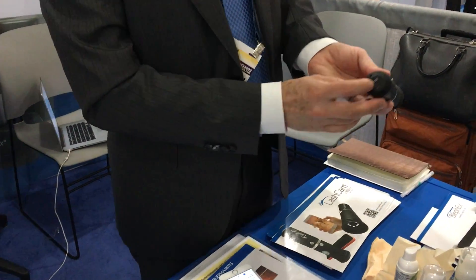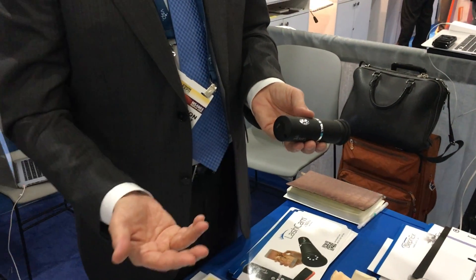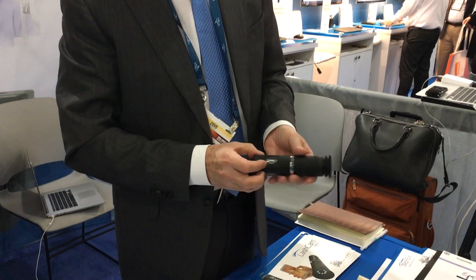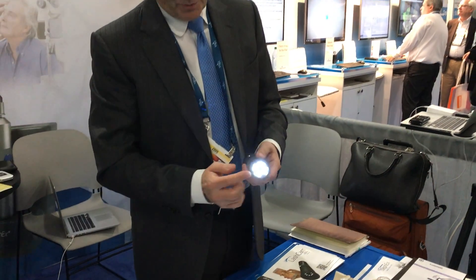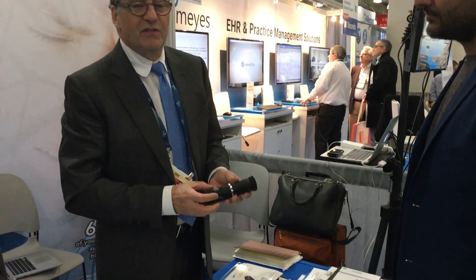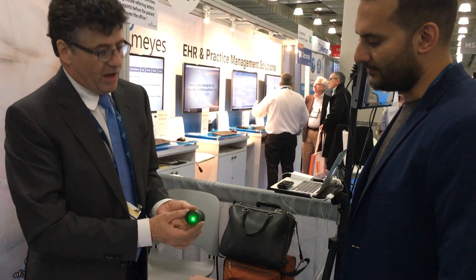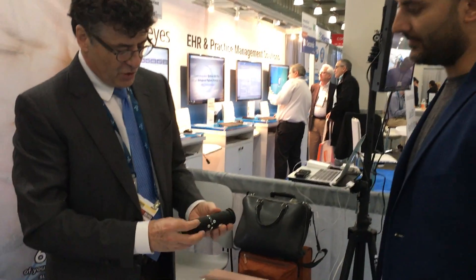Once it's turned on, eventually a green light is going to come on. When the green light comes on, you know the Wi-Fi is working. If the green light doesn't come on, it might need more charge — the LED will come on by itself, but if the charge isn't high enough, the Wi-Fi won't. Check for the green light. The green light's flashing, so the Wi-Fi is on.